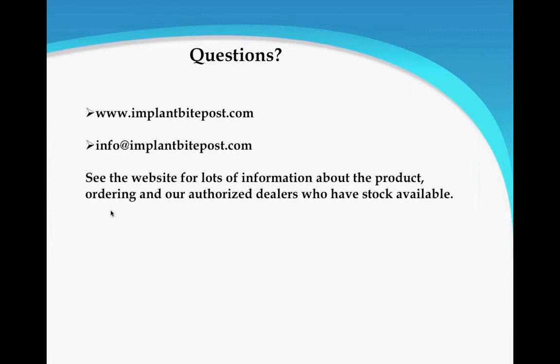I've been around when we first started getting addition reaction silicone bites, and I used to do a demonstration in my laboratory for dentists that would come to town and see me. I would mount in models that could interdigitate with each other. I would pick the stone off and set them as well as I could, and then I would cut the bite material after I would mount it, and then I would cut the bite up and put the bite in. 99% of the time, it's off a little bit. It is just the way it works.